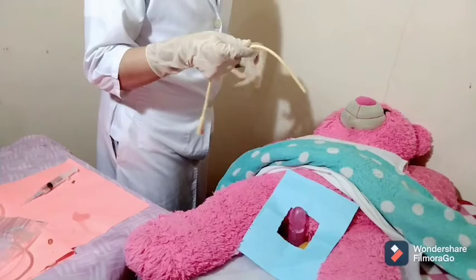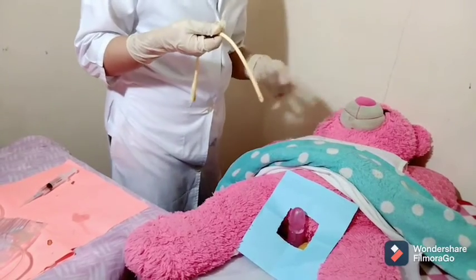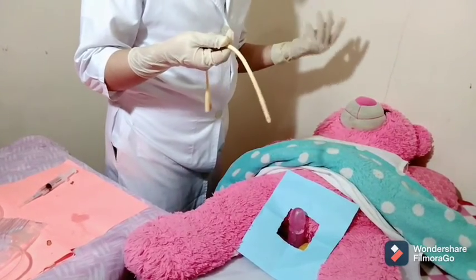Do not force the catheter through the urethra. The sphincter relaxes and the catheter can enter the bladder easily when the client relaxes. Ask the client to breathe deeply and rotate the catheter gently if slight resistance is met. Sir, I am going to insert a catheter, so please take a deep breath.